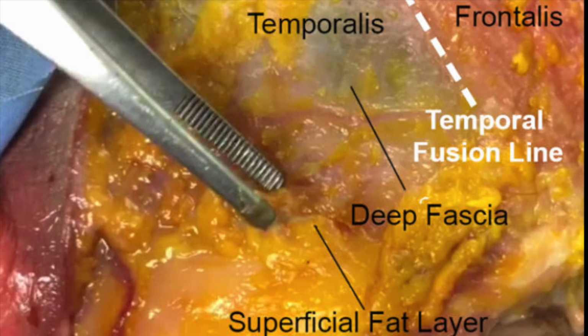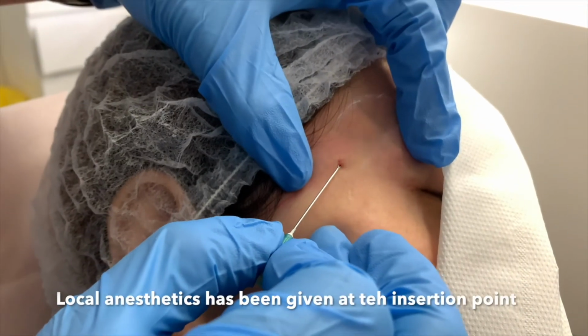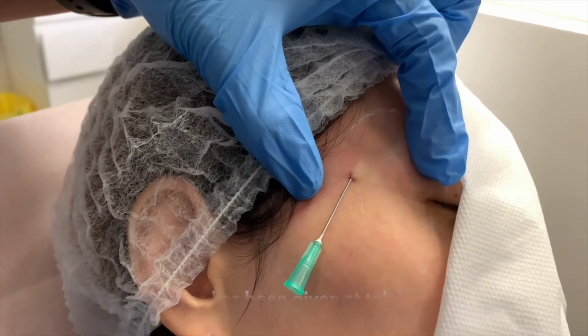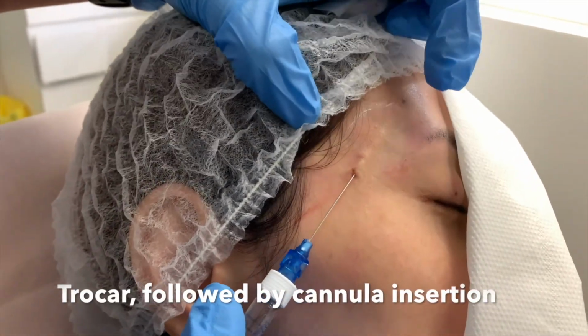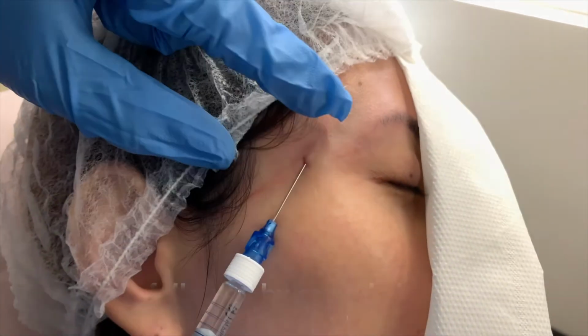The most superficial plane to place the filler is the superficial fat plane. This is below the superficial fascia, therefore below the artery. To inject in this plane, a cannula is used, and it passes easily through the fat. A needle is not used, as there are usually superficial veins. One can easily puncture them, causing massive bruising, and if the needle inadvertently goes superficial in its course, it can injure the artery in its path. A cannula may also hit the artery in the same manner, but the risk is a lot lower.